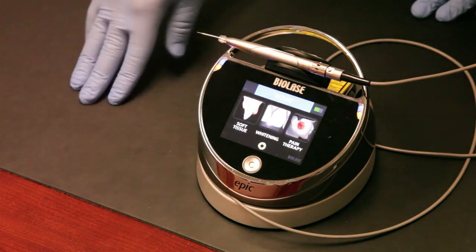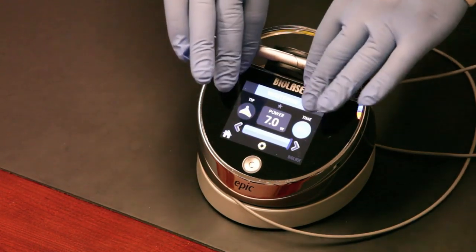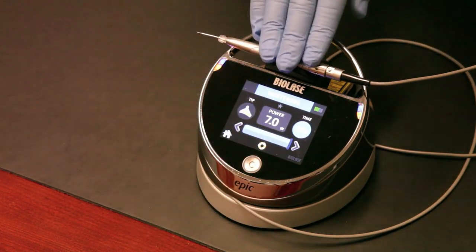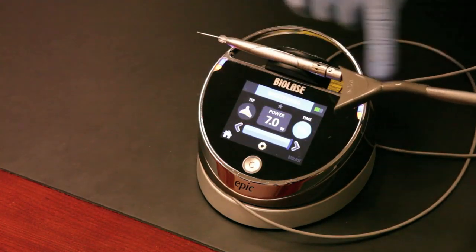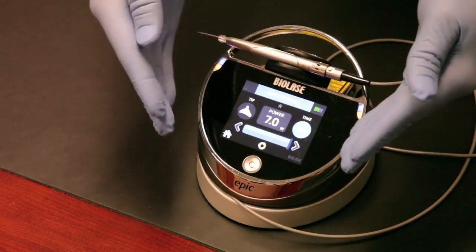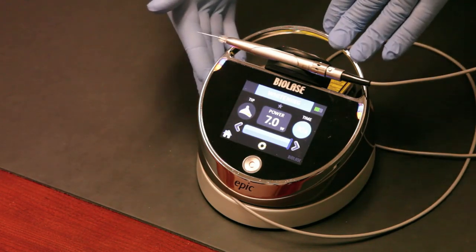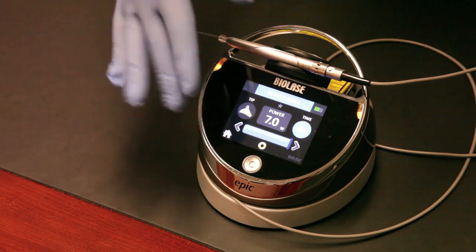For whitening, go back to the home screen and enter the whitening section. It's got presets in 30-second intervals. When whitening with a laser, you use the whitening handpiece attached to the fiber in 30-second increments, set up the patient with gel, isolate the gum tissue, and for 30-second increments three times per quadrant, you'll whiten — getting six to eight shades of difference in less than an hour of treatment time.